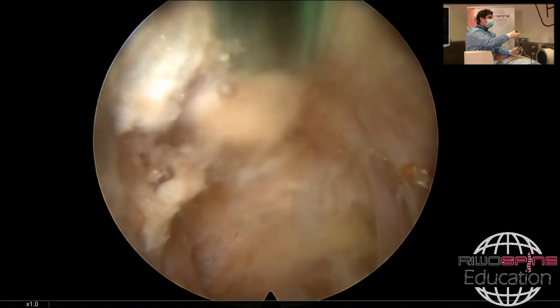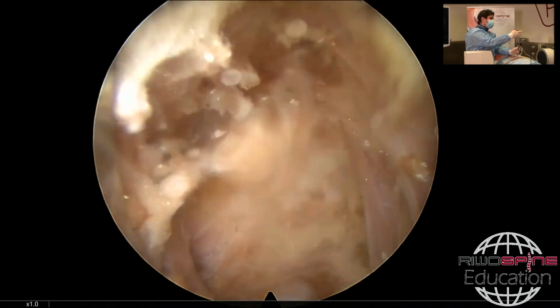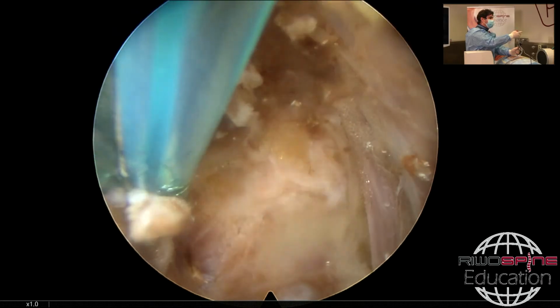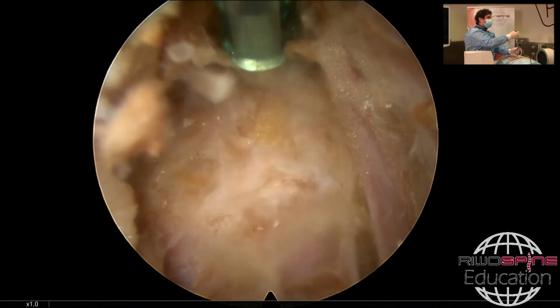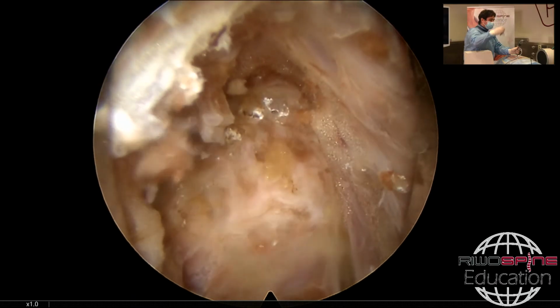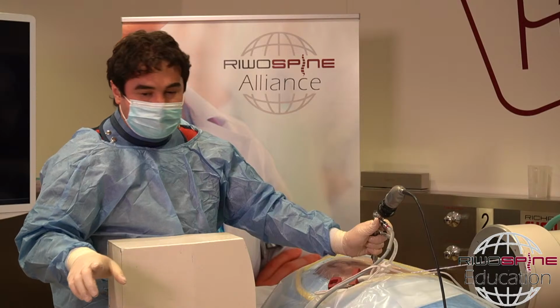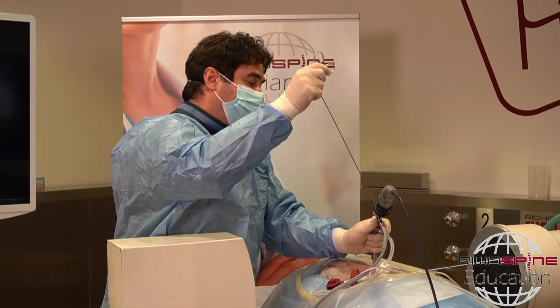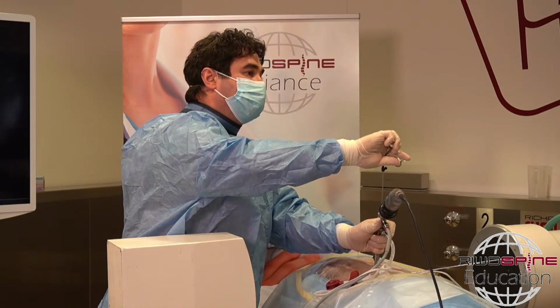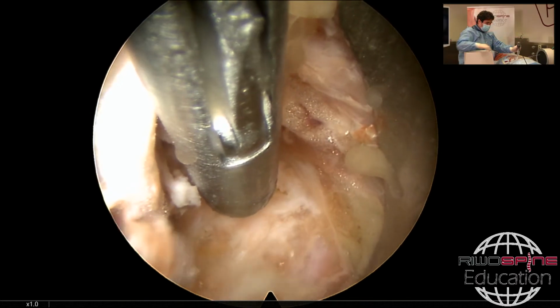I will show you how far we can reach without any bony resection, just a 2 or 3 millimeter incision on the flavum, and then we are at the caudal side of the level. Can I have the rongeur? Okay, then if there is a fragment located somewhere here, then we can easily reach there. Then I would like to show you where we are.